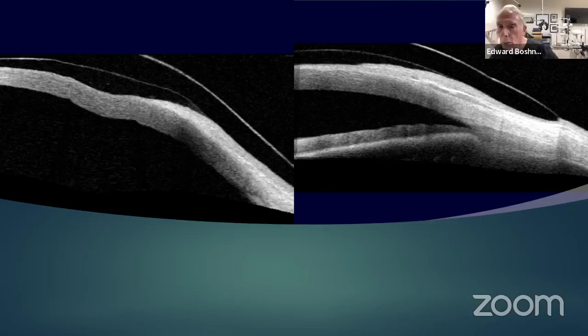I don't think so. If the lenses fit well and you follow the patient along, everything has a risk, but you have to take into consideration the risk-benefit ratio. And when it comes to these compromised corneas, the risk-benefit ratio is definitely going to be in favor of the patient. So as long as the patient is being watched, monitored, I don't think there's anything to be concerned about.